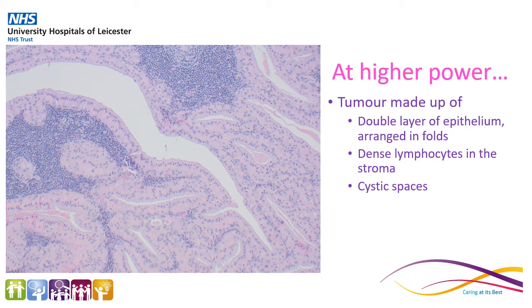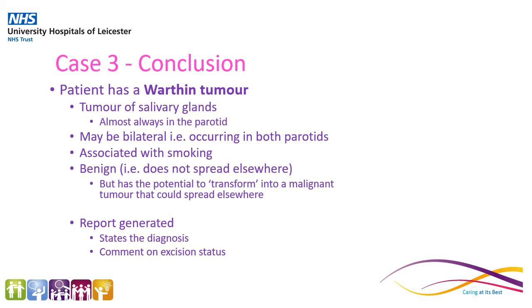Looking at this tumour on higher power, it has a really quite unusual appearance. It's made up of a double layer of epithelial cells, which are these light-coloured ones, and these are arranged in complex folds. The stroma, the underlying tissue of the tumour, has areas of dense lymphocytes — the blue dots we've seen before — and it also has these cystic spaces. Case 3 is an example of a Warthin's tumour. This is a tumour of the salivary glands and almost always occurs in the parotid. They can be bilateral and they are associated with smoking. They are a benign tumour, i.e. they do not spread elsewhere, but they do have the potential to turn into a malignant tumour which could spread elsewhere. We would generate a report stating the diagnosis and commenting on if the tumour is completely excised.